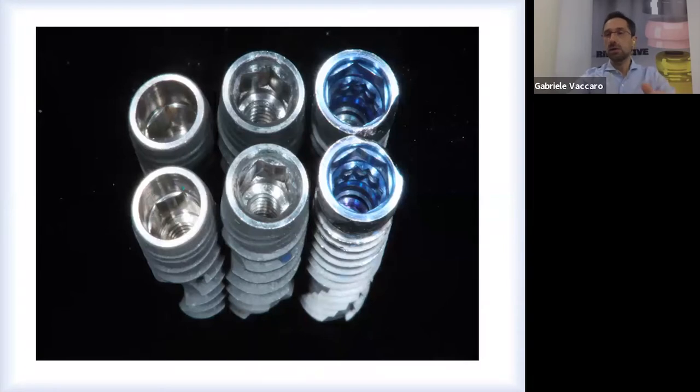They are the most commonly used implants on the market because they are easier. They have a better aesthetic outcome because you save a lot of space for the crown, for the technician. It's easier to put different kinds of abutment over the internal connection to compensate for surgical problems and misplacement of the implants. But we again used them improperly, because we started to use the internal connection also for multiple-fixture restorations.